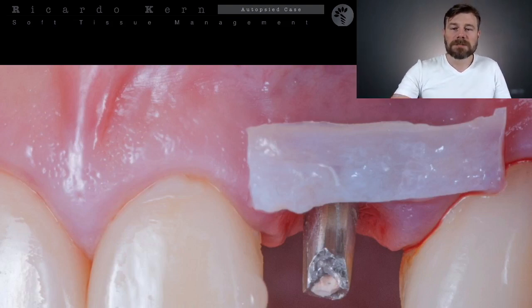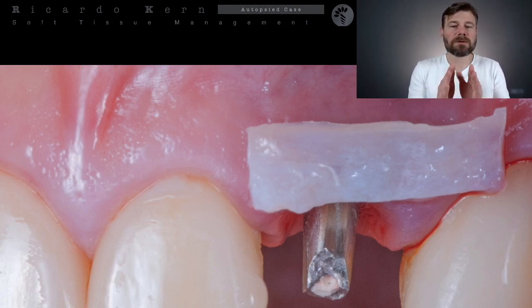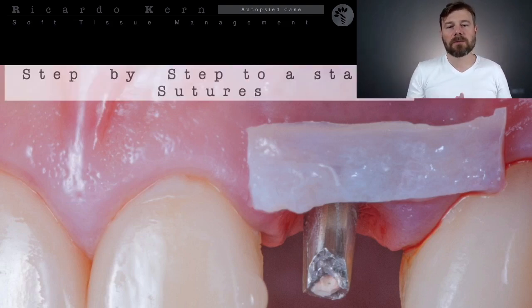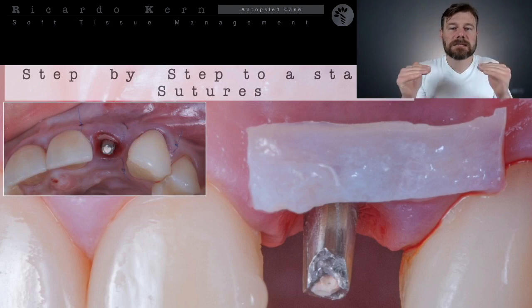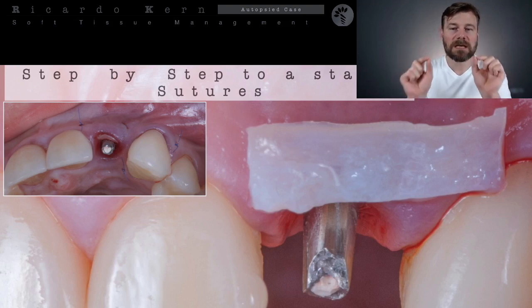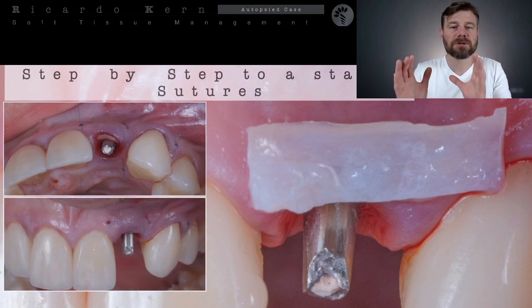Okay, at the time of the sutures we need to bring and tunnel these sutures inside the area that we just treated. As you can see here, we do not involve the mesial papilla in the grafted area. Why is that? Because I do not need to overgraft this area. And as we don't need to advance the cervical margin coronally, usually we just restrict the tunneled area to exactly a size a little larger than my connective tissue.